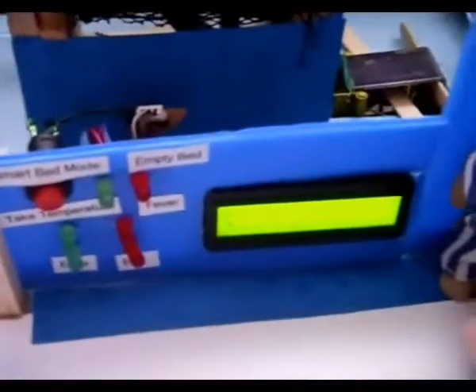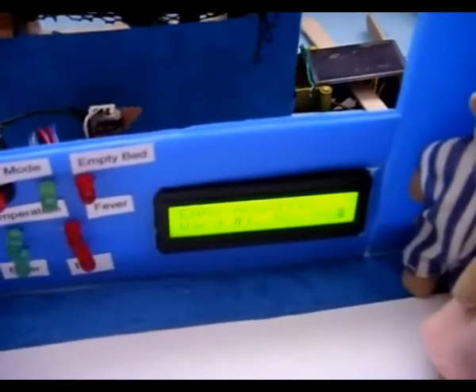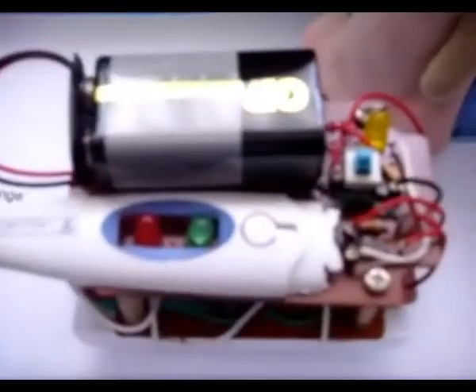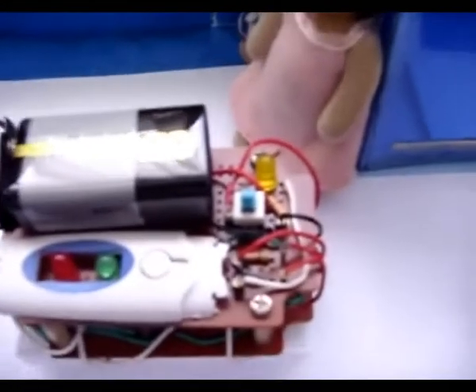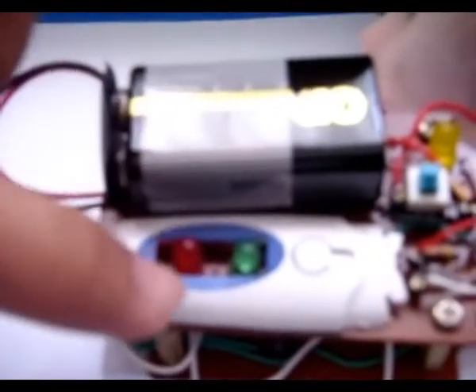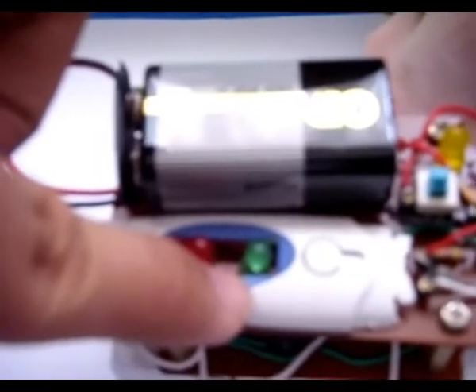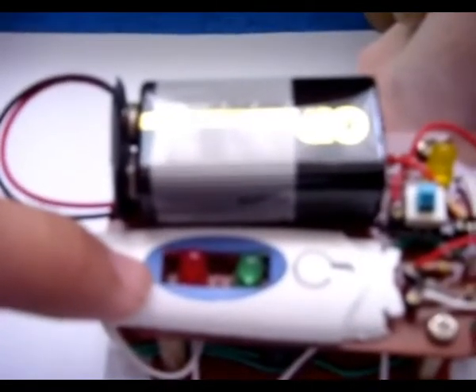Let us now take the temperature with the wireless thermometer. I'll give a brief introduction to this wireless thermometer. As you can see over here, there's a switch to turn it on, and there are 2 LEDs. The green one shows the temperature taking status, and the red one shows the fever status.